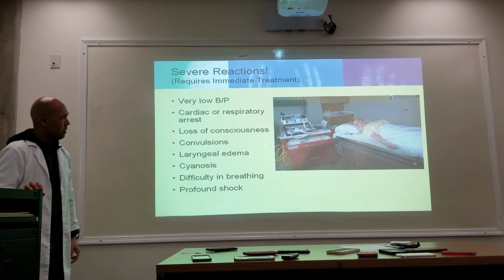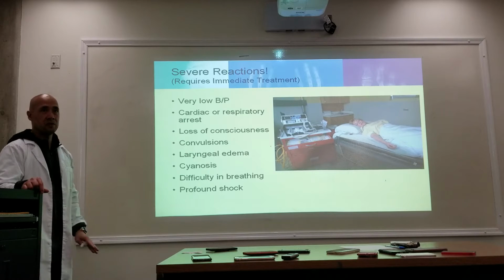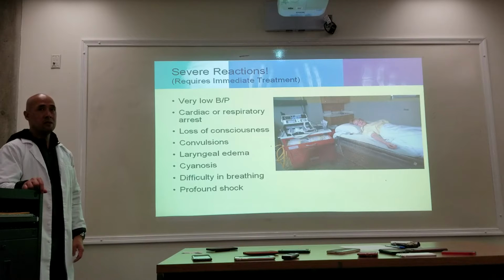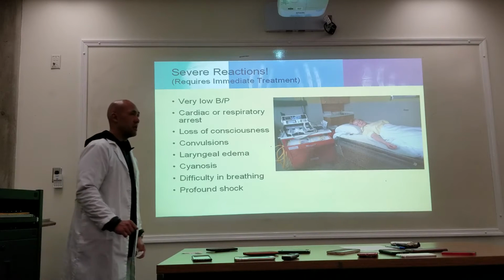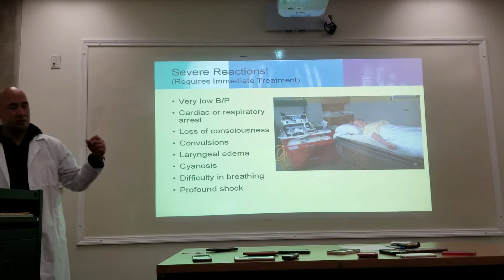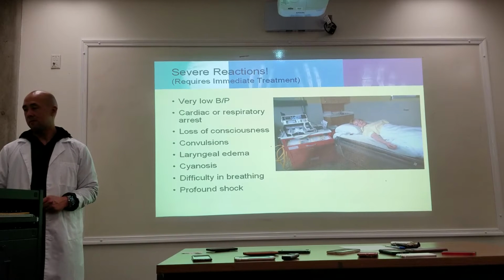Now, where do we perform iodinated contrast procedures? IV contrast procedures, CT. Okay, in radiology, what should you, let me rephrase this, that was kind of vague. What should you have in your room if you're performing these procedures? A crash cart. It should be easily accessible.